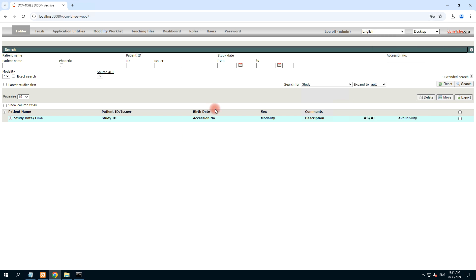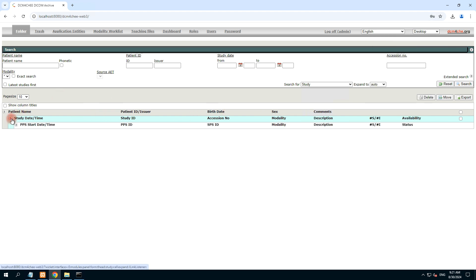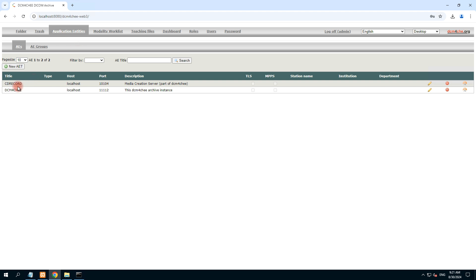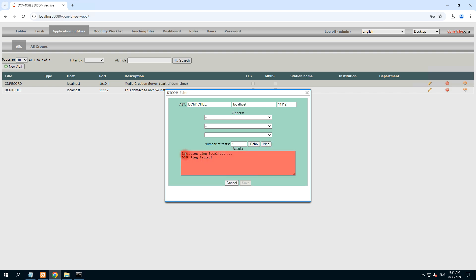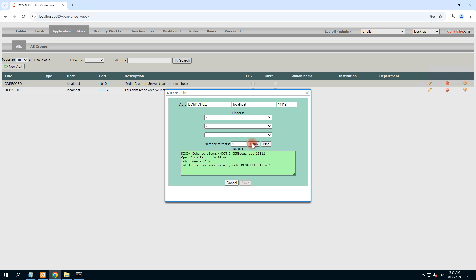It's working now. This is the application entities section — you need to check if it's working. There is a DCM4CHEE localhost AE title. This is a static IP but instead of IP we are using localhost. This is the unsecured port. Check echo and ping — the echo should be green. Execute ping to localhost as well. It is done — the echo is working.